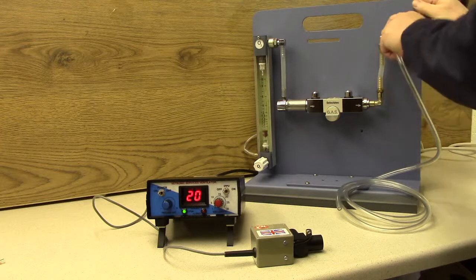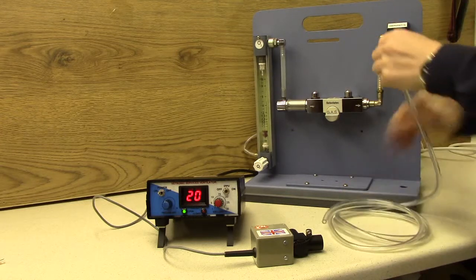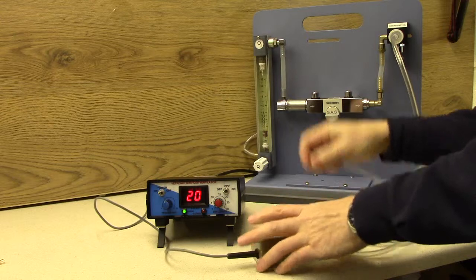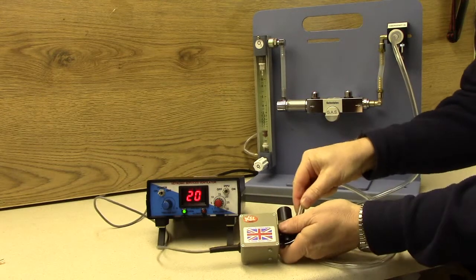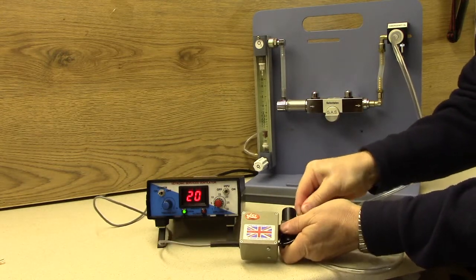You'll need a supply of fresh gas from your anaesthetic machine, so connect the 22mm connector to the fresh gas outlet and the other end of your clear tubing to the oxygen inlet port of the valve.